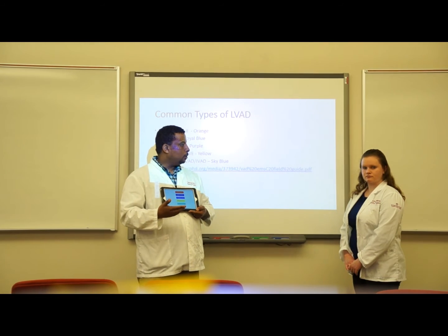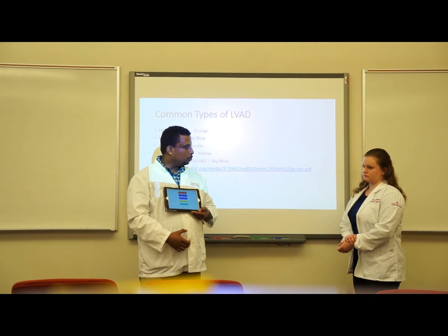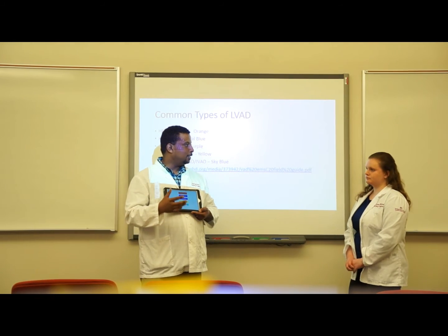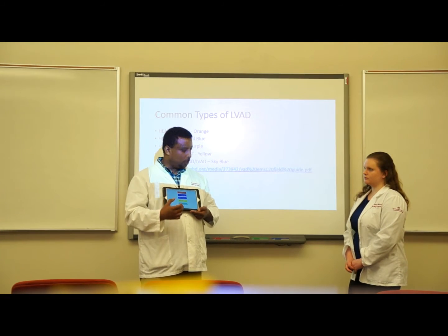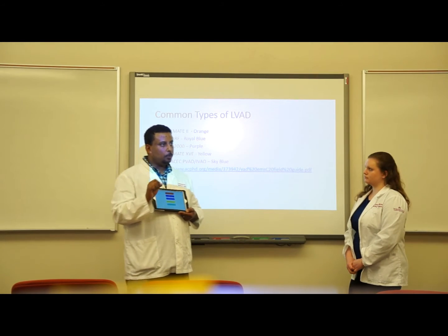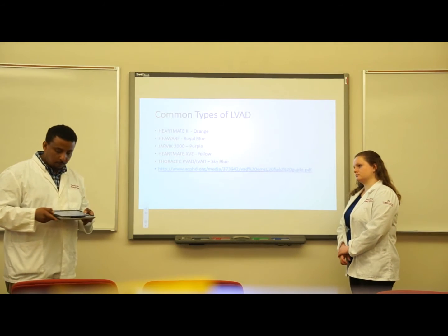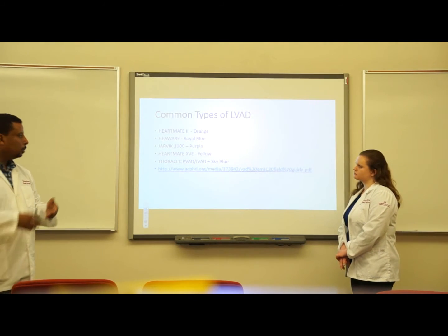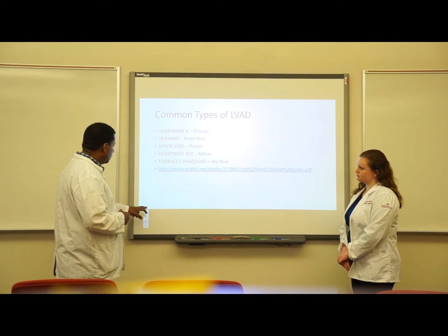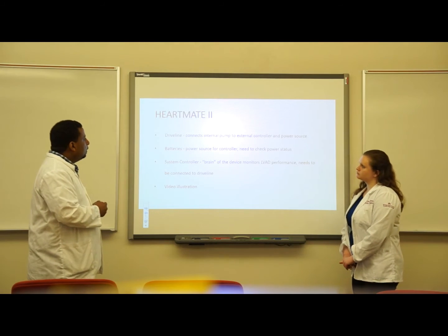And then when you have this patient, when you do your initial assessment, it's very important to look at the controller and see the color port. They try to make this universal, so every patient with an LVAD unit will have this color port system. And then at the back of that paper, it may also tell you where the device was implanted, by what surgeon, and any other pertinent information. So I thought that's also important for the patient to know what kind of device they have.